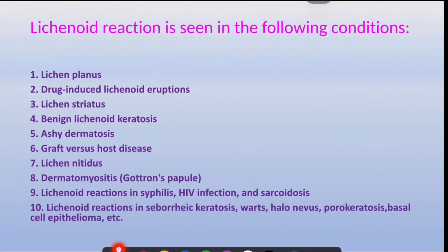So, you have to remember what are the conditions where you can find lichenoid reaction. First important, which you are getting mostly in your exam, is lichen planus.